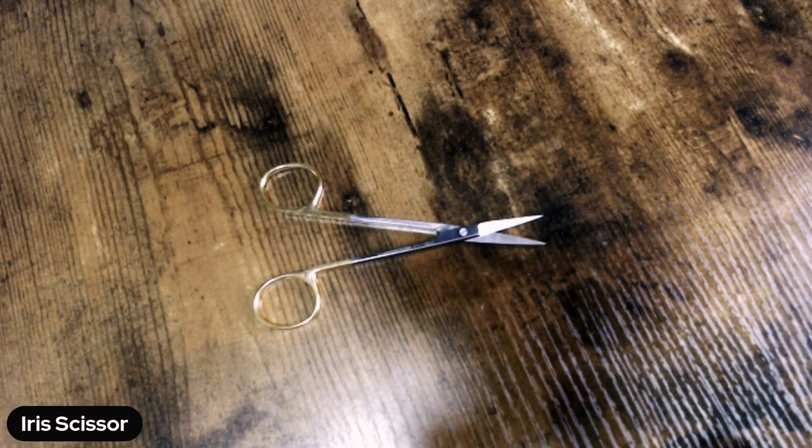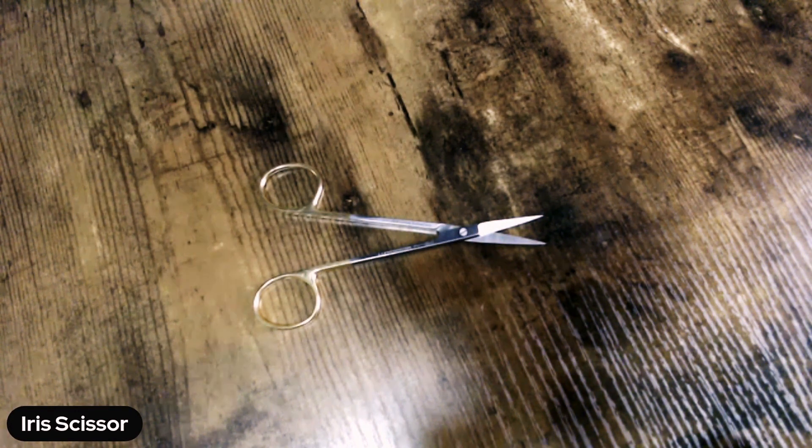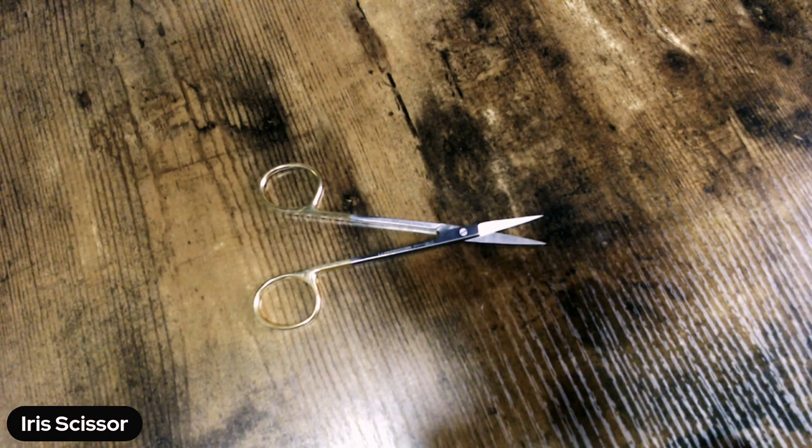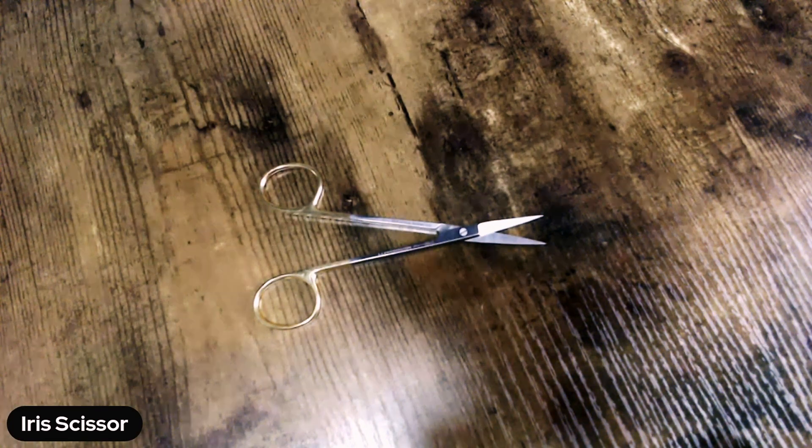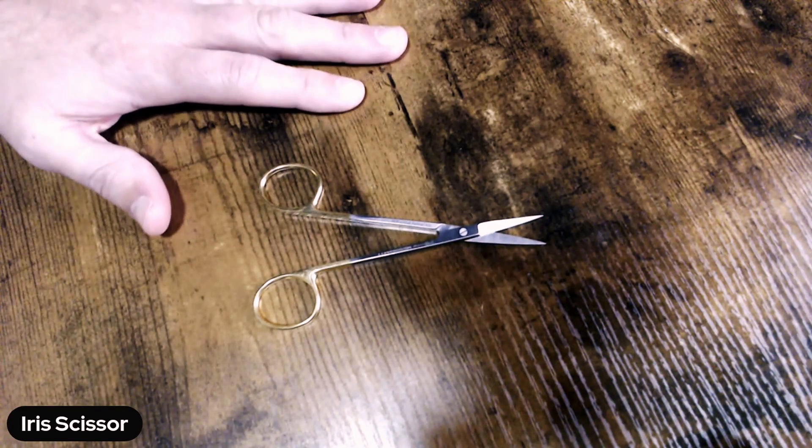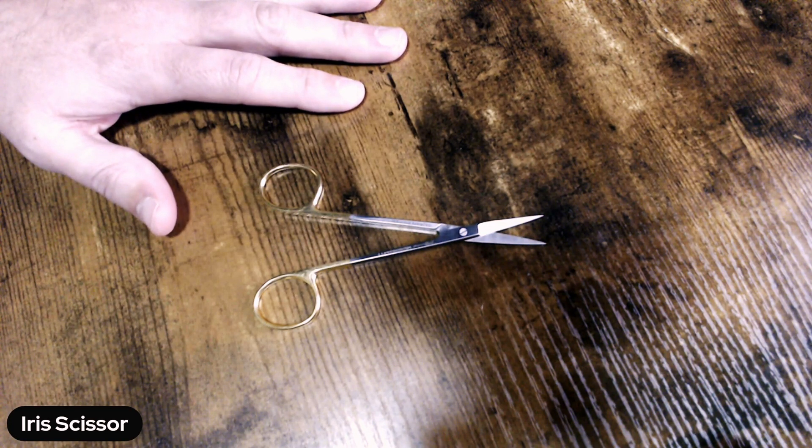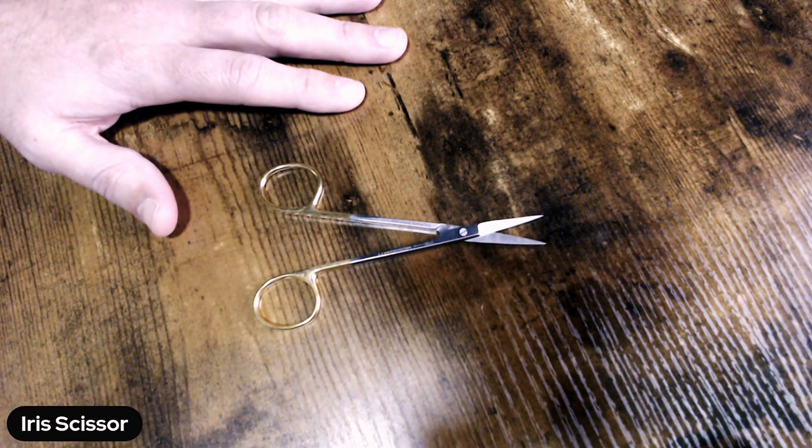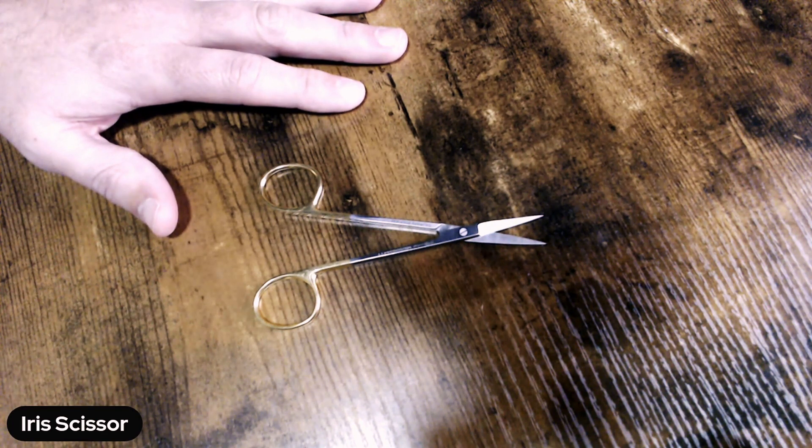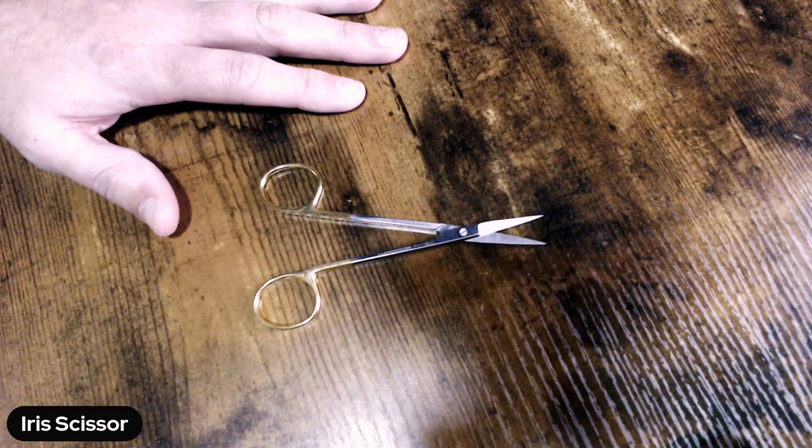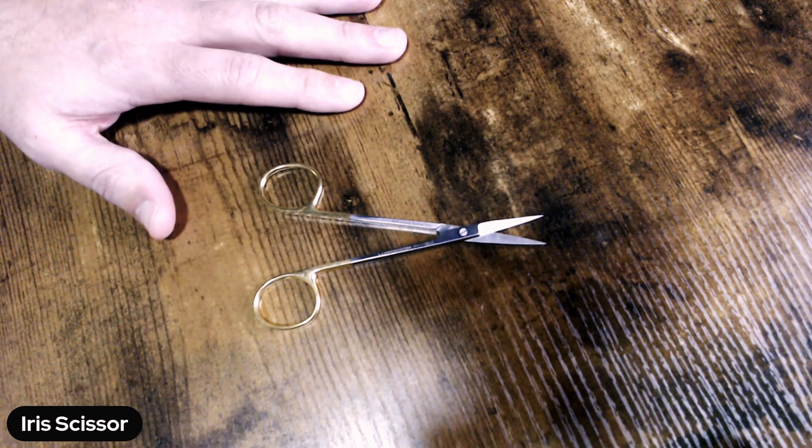Hello, my name is Iris Scissor and today you're going to get to know a little bit more about me. This particular iris scissor that we have in front of us today is a 4.5 inch tungsten carbide sharp-sharp iris scissor. Now I'm going to talk about a couple of those identifying marks on this particular device.